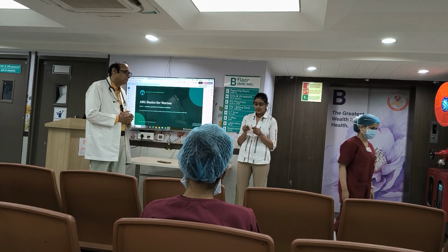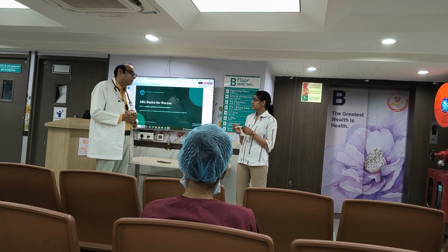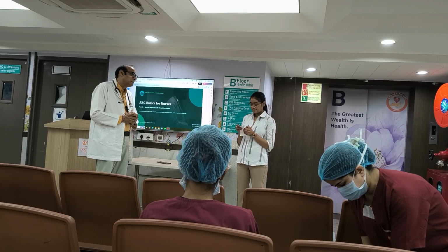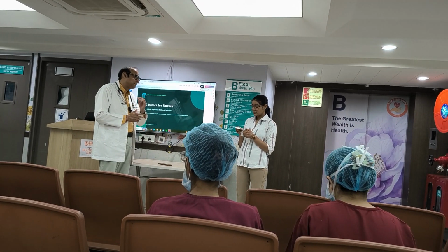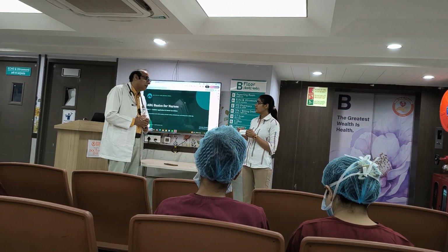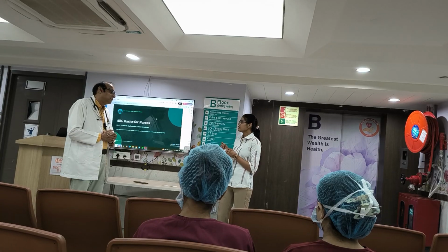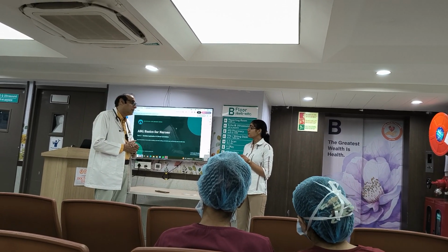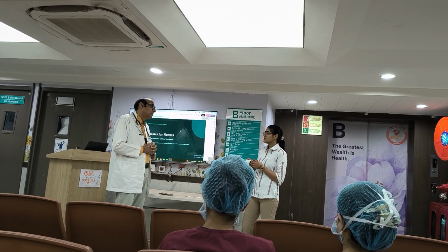पहले पेशेंट का नाम चेक करते हैं, फिर डेट चेक करते हैं, टाइम चेक करते हैं, ओके फिर ये पीएच, इसका नॉर्मल रेंज होता है 7.35 से 7.45. ओके और इसमें सर 7. What does pH mean? पीएच का क्या मतलब होता है?